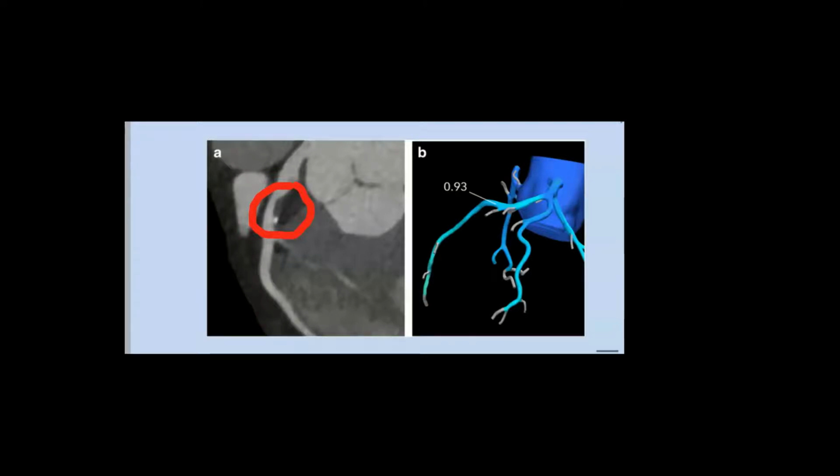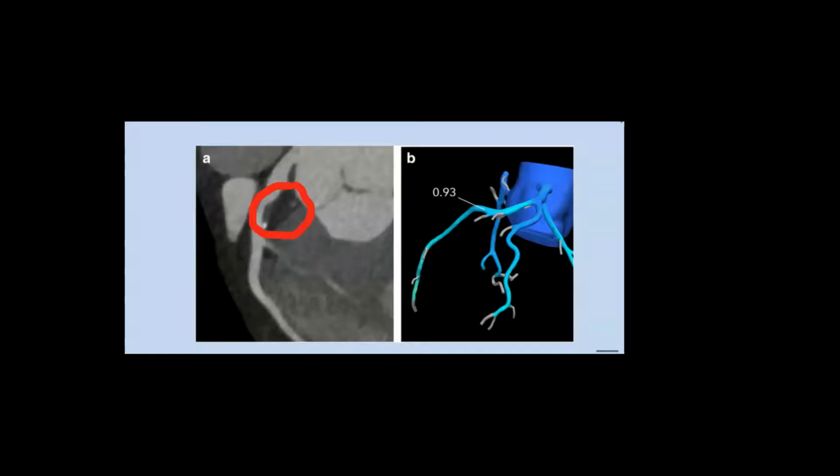Okay. Can you get these things by cardiac MRI? No. When it comes to the coronaries, cardiac MRI is out. For muscle, for ischemia, for viability, for volumes, ejection fraction, gradients, stuff like that, yes, but not for coronaries.